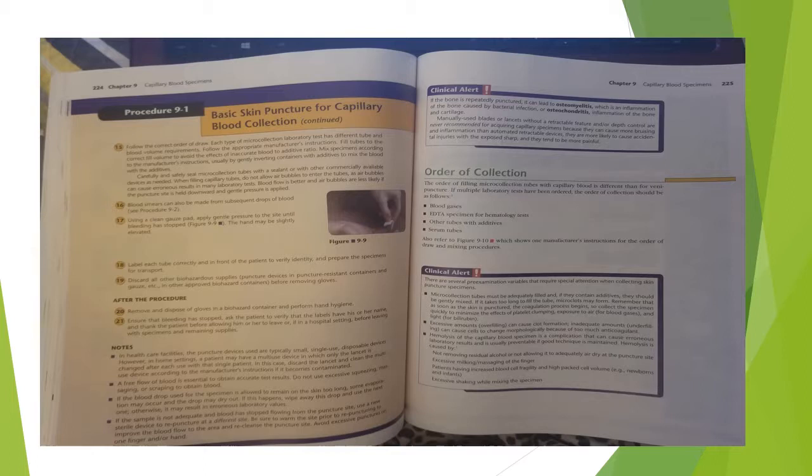Mix specimens according to the manufacturer's instructions, usually by gently inverting containers and additives to mix the blood with the additives. Carefully and safely seal microcollection tubes with a sealant or with other commercially available devices as needed. When filling capillary tubes, do not allow air bubbles to enter the tube, as air bubbles can cause erroneous results in many laboratory tests. Blood flow is better and air bubbles are less likely if the puncture site is held downward and gentle pressure applied.